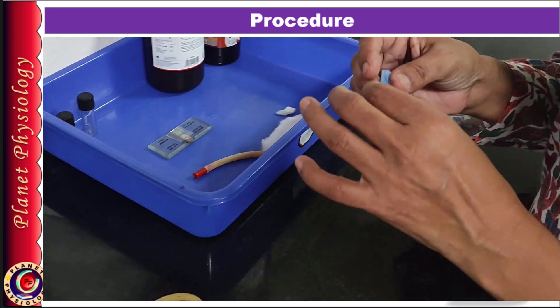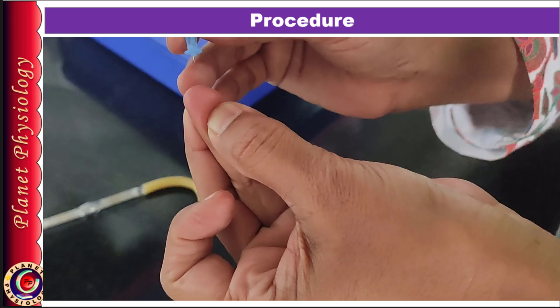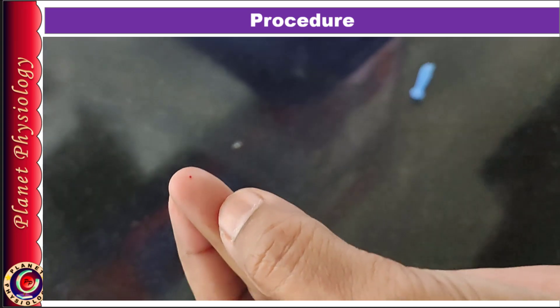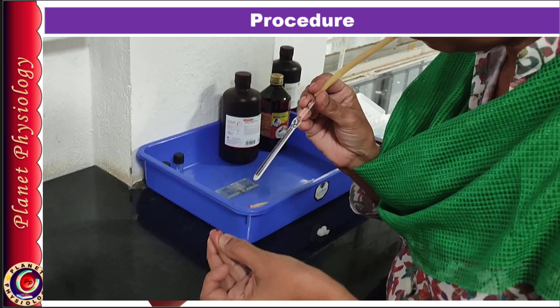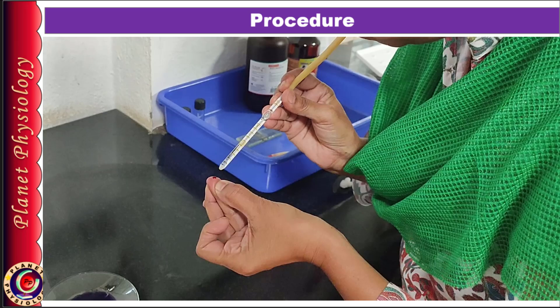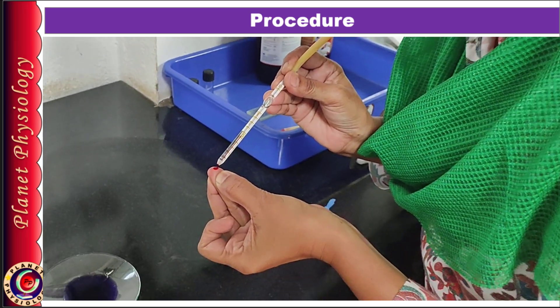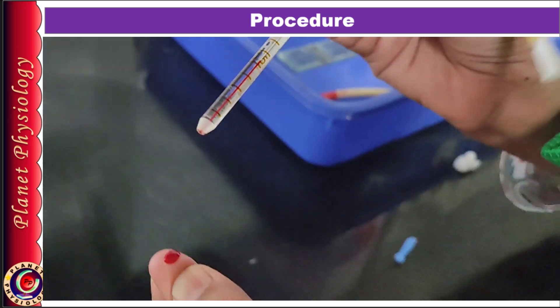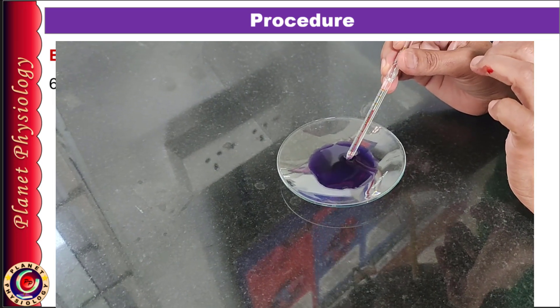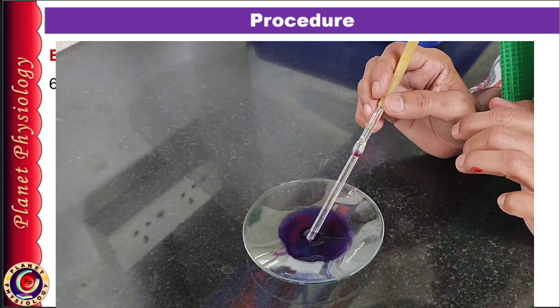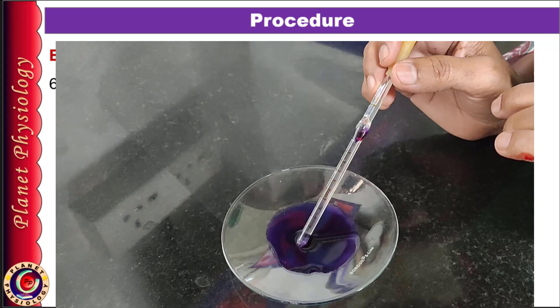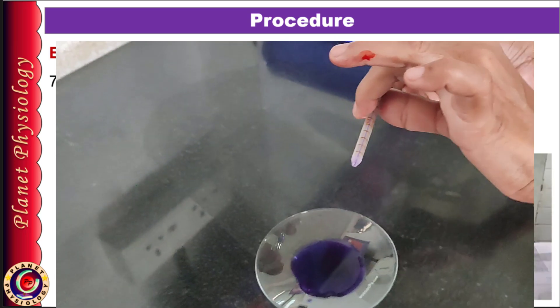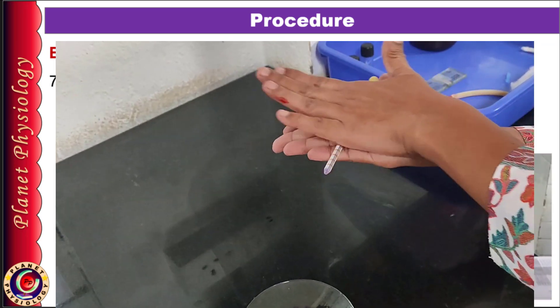Once background preparation is done, you are ready to collect the blood sample. Take a bold finger prick by following all aseptic precautions. Wipe away the first drop with dry cotton and allow an adequate-sized drop to form on the fingertip. Place the tip of the pipette within the drop and gently draw blood exactly up to the 0.5 mark without any air bubbles. Note that the 0.5 mark is the line below the number. Then wipe the tip of the pipette to remove excess blood, immerse it into the diluting fluid, and draw it up to the 11 mark. Mix the contents thoroughly by holding the pipette horizontally between the palms and rotating it. Wait 2 to 3 minutes for completion of hemolysis and staining of the WBC nuclei.